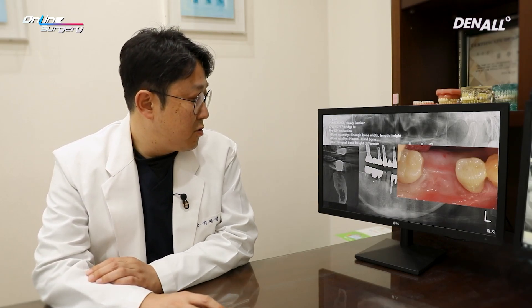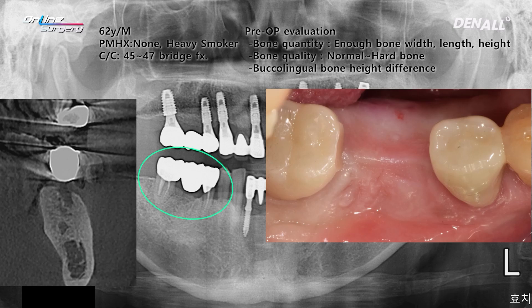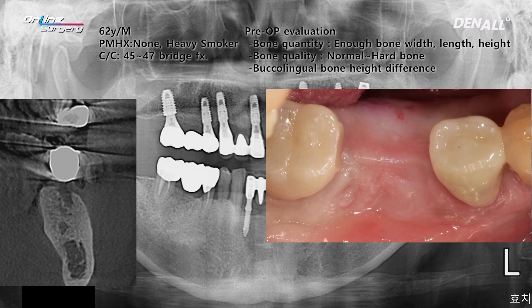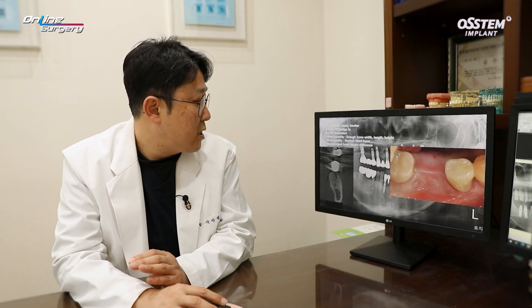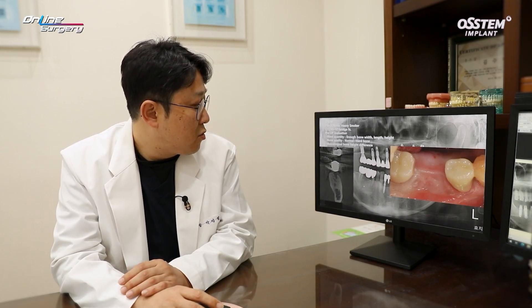This is the initial visit photo. From number 45 to 47, there was a bridge — a zirconia bridge — and the pontic part of the bridge fractured. It was decided to remove the pontic part and deliver an implant restoration. On panorama and CT, there was enough bone quantity in terms of width, length, and height of alveolar bone, and there was enough distance to the inferior alveolar nerve.